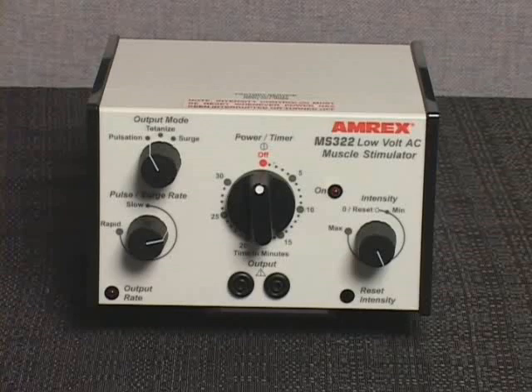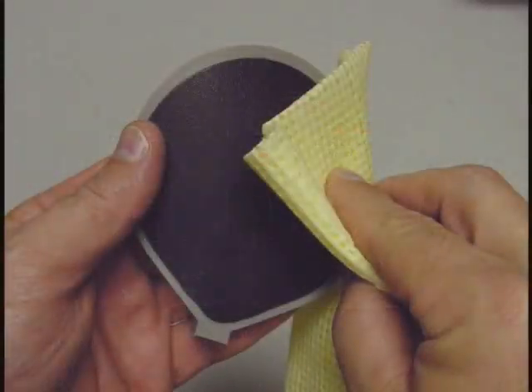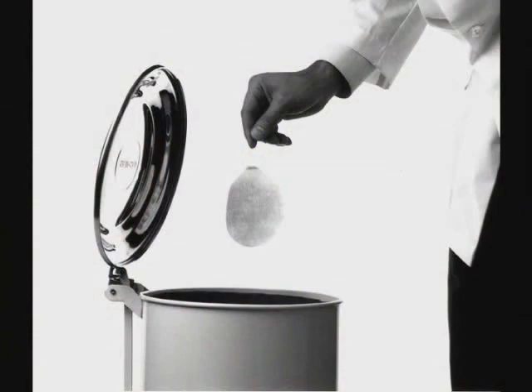To prematurely end the treatment, rotate the power timer knob counterclockwise to the off position. The AC power will shut off and a bell will sound. Thoroughly clean the pads with warm water and dispose of the used cloth covers after every treatment.